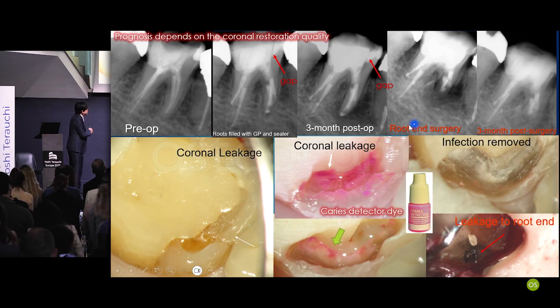So I removed the infected dentin. Then in addition to that, I did root end surgery. So it's very important to close the gap between the composite and the tooth.